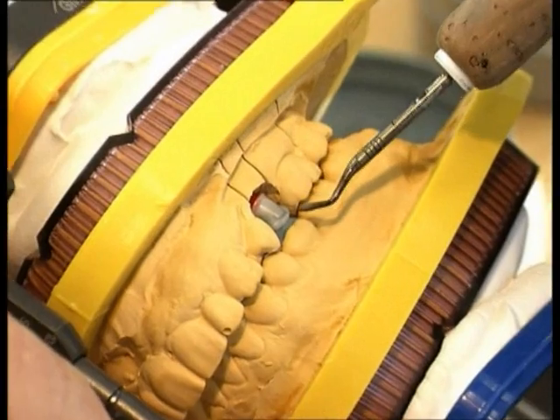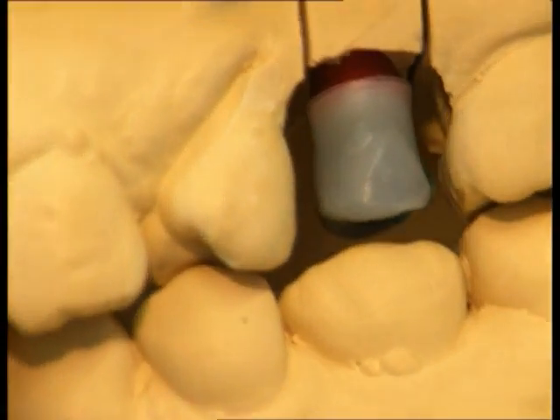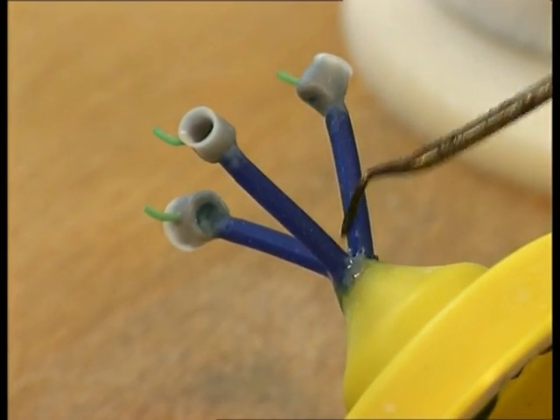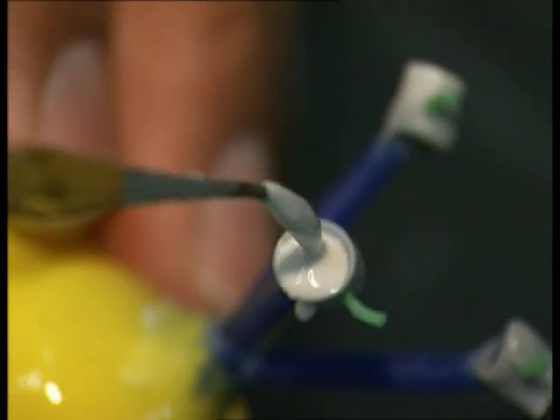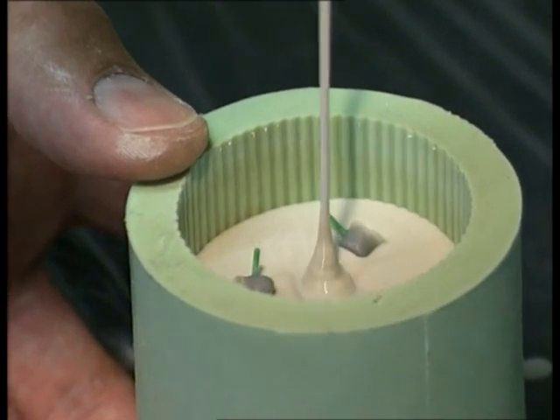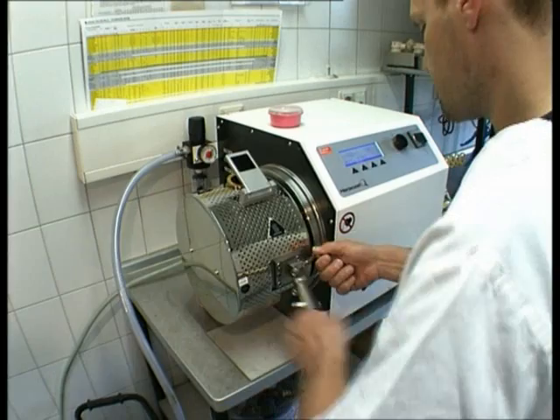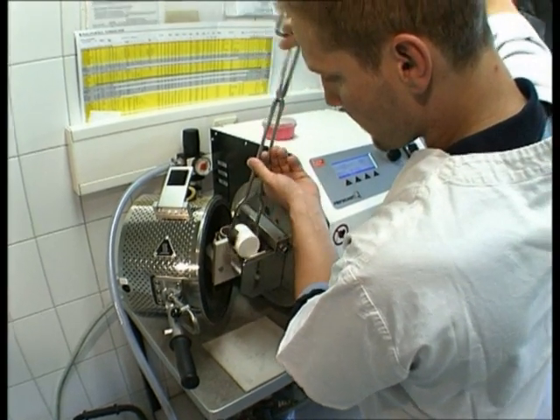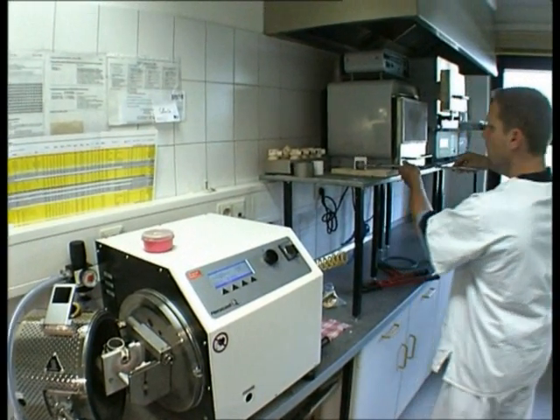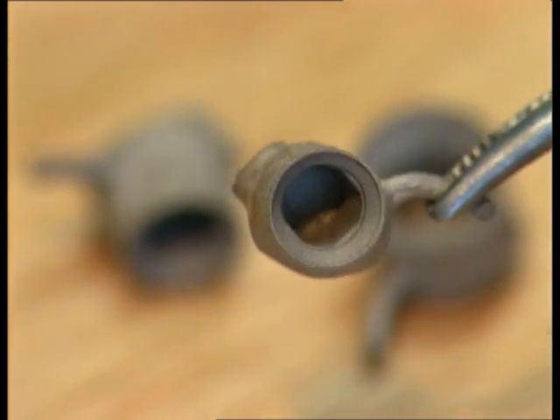Once this is done, the crown framework is waxed up as usual according to standard veneering techniques. Once completed, the superstructure model is invested. After the initial casting, the snap-on mechanism must be removed with the reamer before placing the casting on the analogues.